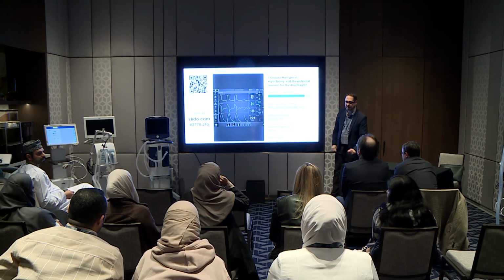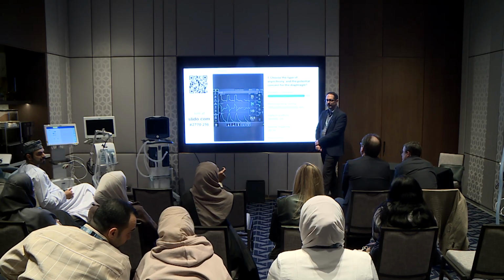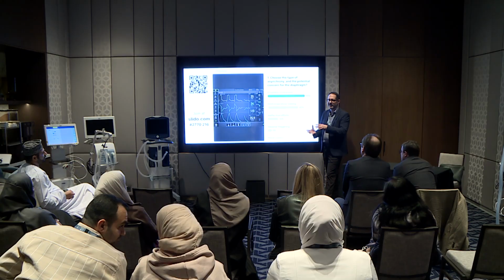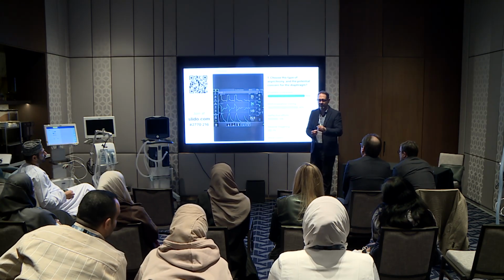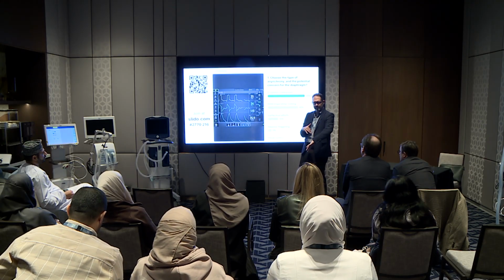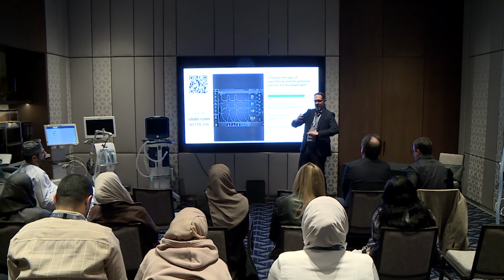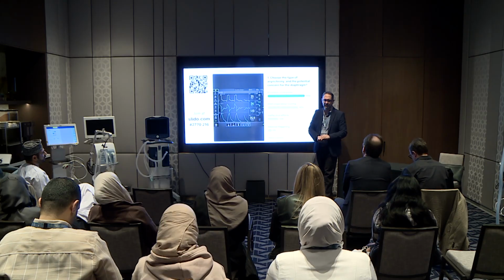Question: so the difference between eccentric contraction and post-inspiratory loading is the dip behind after the... Yes. Essentially, it's eccentric contraction that happens immediately after concentric contraction. So concentric is normal. You trigger and the ventilator gives support. That's a normal action of the diaphragm. It contracts, volume gets sent to the patient. When the volume gets sent to the patient and then it starts to exhale and you're still contracting, you have a combination of concentric and eccentric, so they're renaming it post-inspiratory loading.